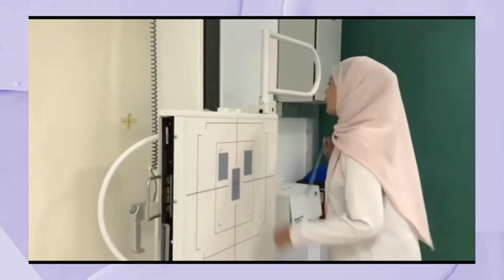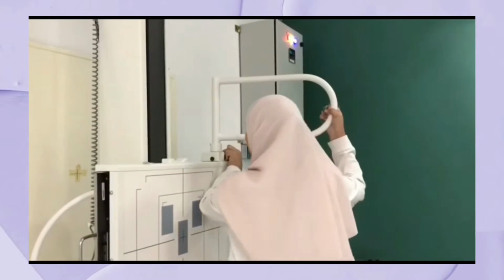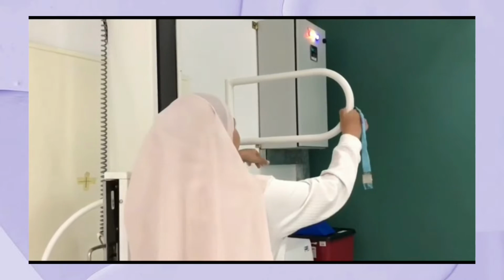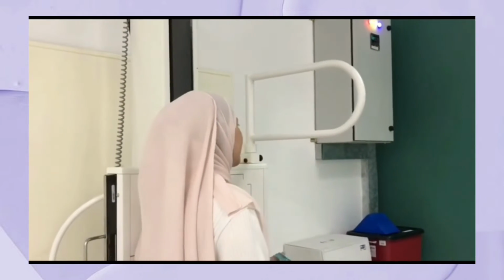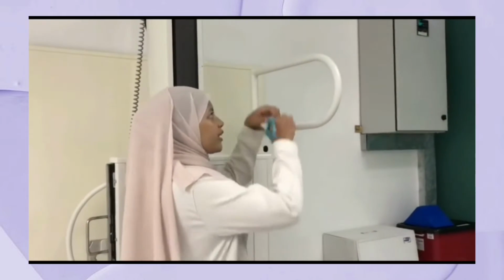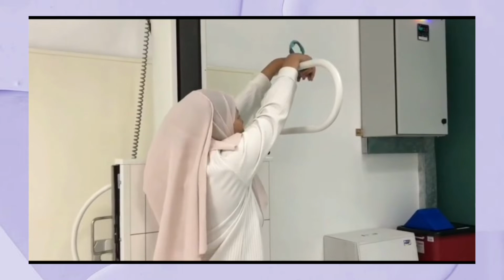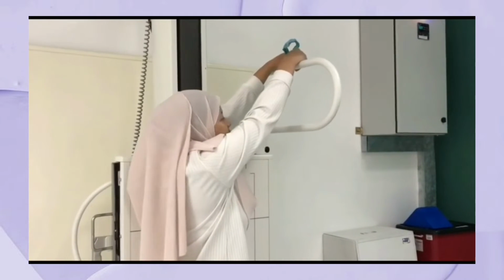Okay. At this side, there is this for your patient to place their hand. As an example, when we're doing a lateral chest X-ray, the patient's hand should be lifted. So this will help the patient to not move during the examination.